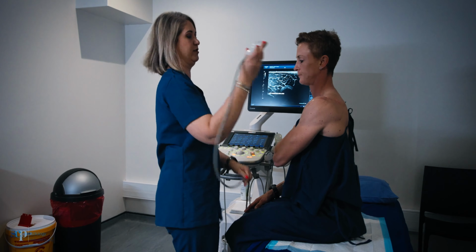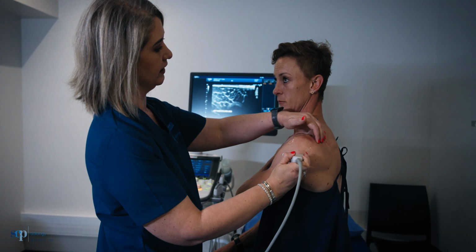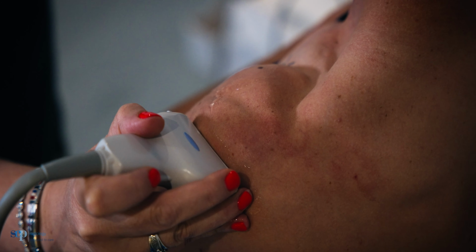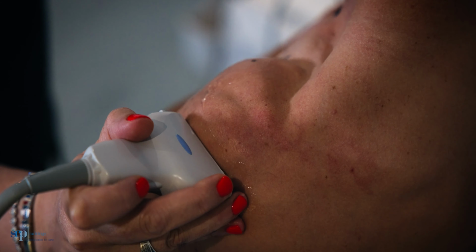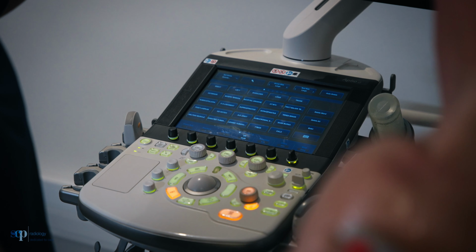They can be normal, they can have a low grade or a mild injury, such as a sprain or a strain, or they could be torn, and we can grade the tear to see if it's a complete tear or it's a partial tear. Likewise, with tendons, we can assess the structure of the tendons. They may be degenerate, they may have a tear, or they may have inflammatory changes related to the tendon.